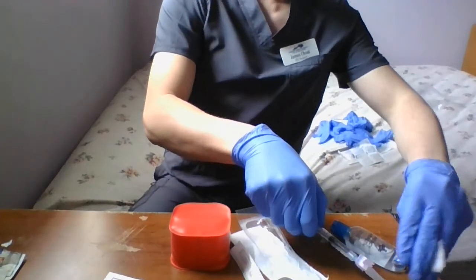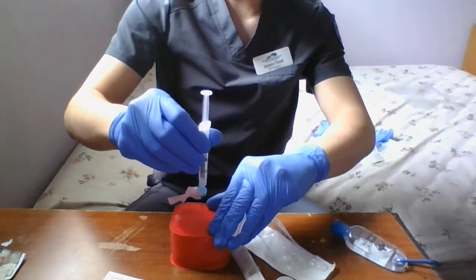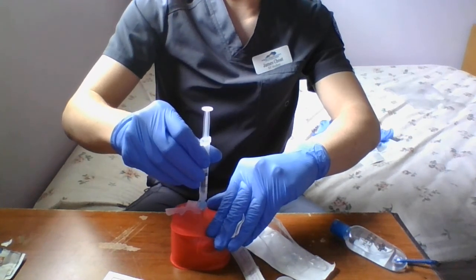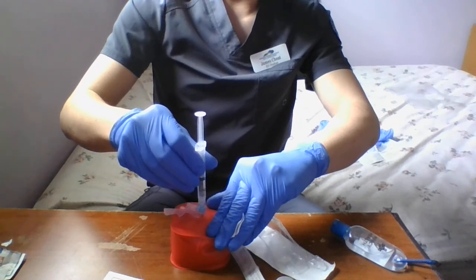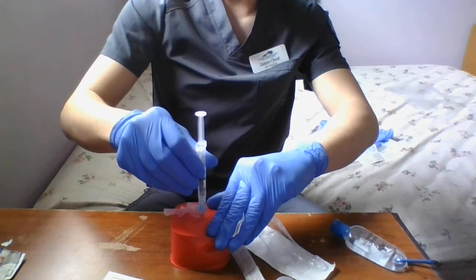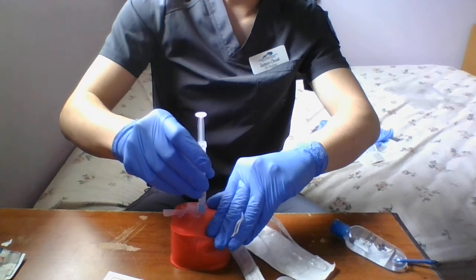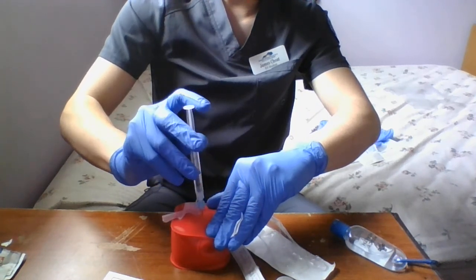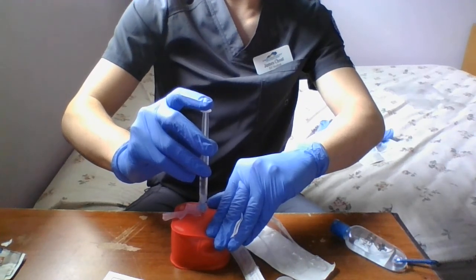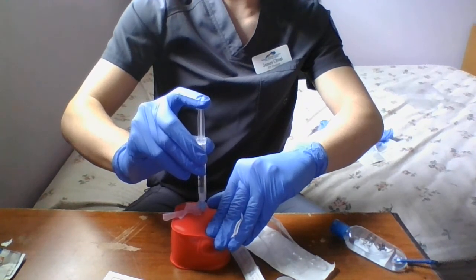Okay, now to the injection. I'm going to take the plastic off. Just going to do it at a 90-degree angle. Quickly inject it. Going to aspirate for 5 to 10 seconds just to make sure that there's no blood. You don't want to have bleeding already. Alright, there's no blood. I'm going to inject the medicine 10 seconds per ml. So, let's go.